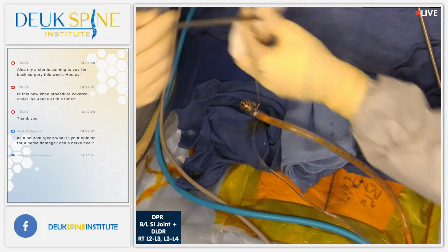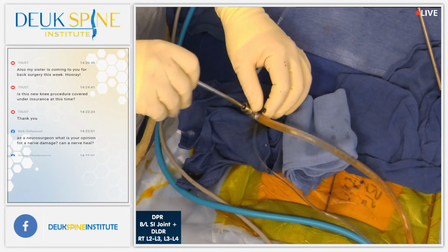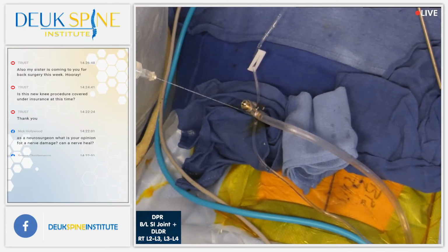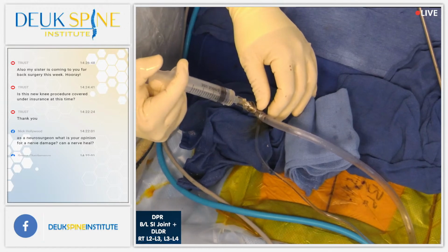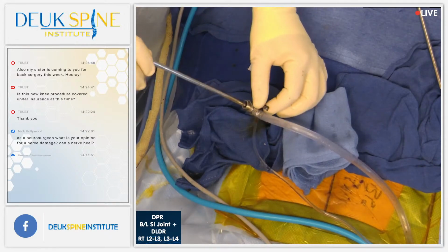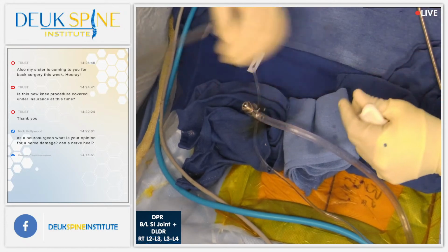What's wrong? Oh, that's fine. She's snoozing, huh? She doing all right, Dr. Burndes? She's comfortable. Vitals are stable. We've just irrigated out the 3-4 disc. Good job, Luis. Oh, it's still clogged?